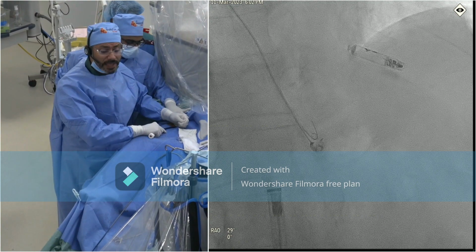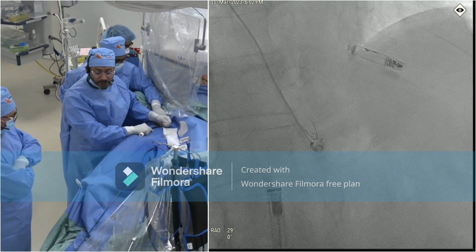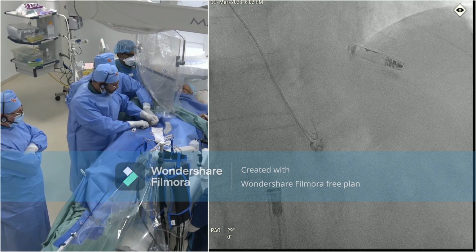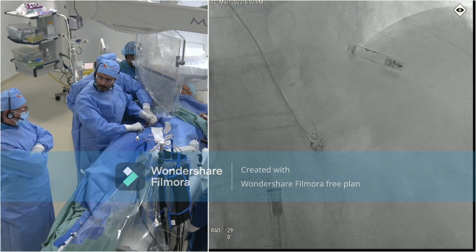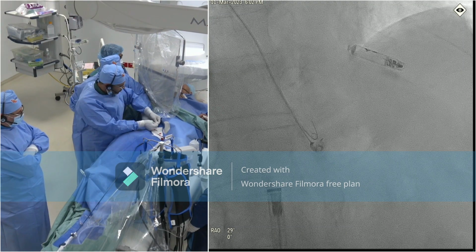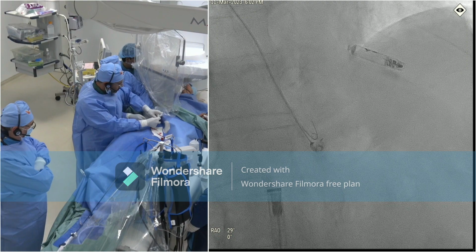And a remaining question, which I find very interesting, and I need Dr. Raed's input. We give, of course, flushing, we give heparin, but do we need to give extra heparin? After I get the vascular access, I give between 3,000 to 5,000. This patient, we did give 5,000. The system is out. So we routinely do that, yes.